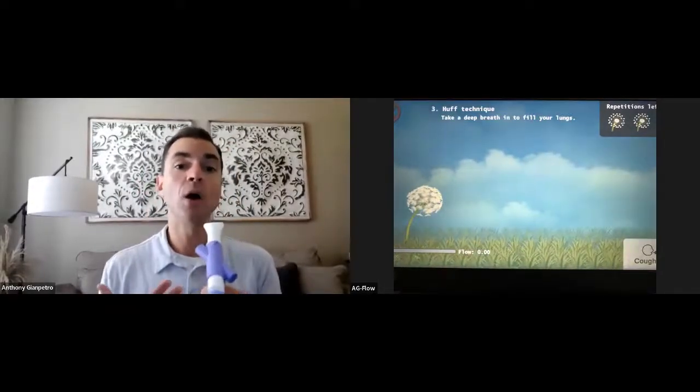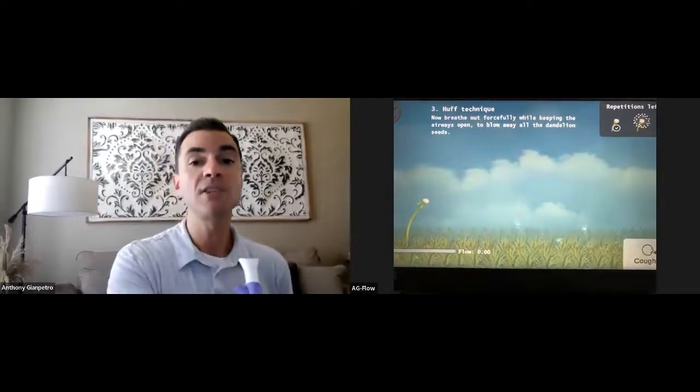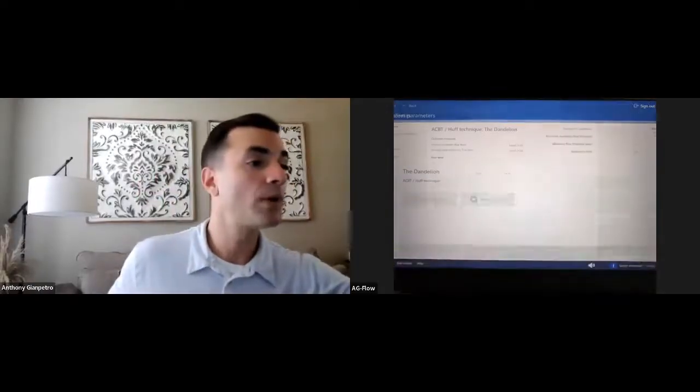If I don't do a good enough breath, I won't move the dandelion seeds as far. So you can adjust that parameter as needed in the initial setup. Let me take you back there for a final review on this one.